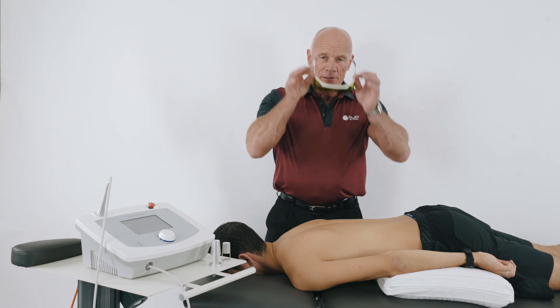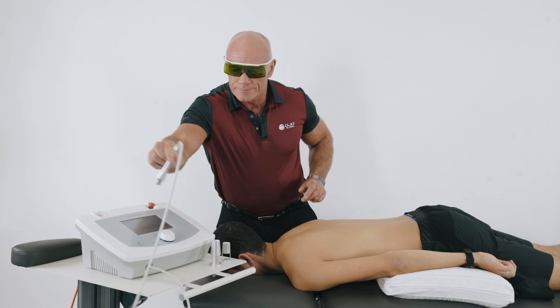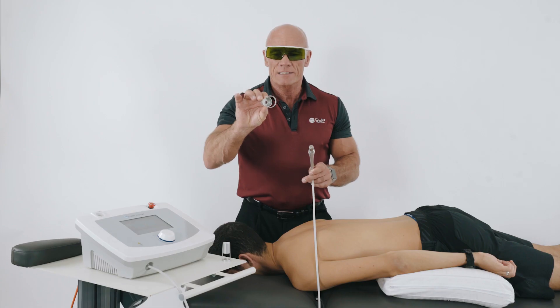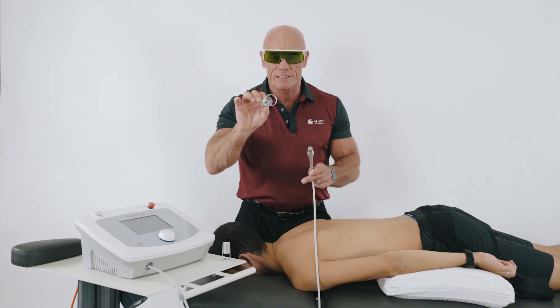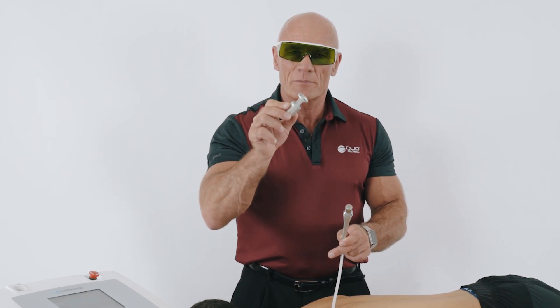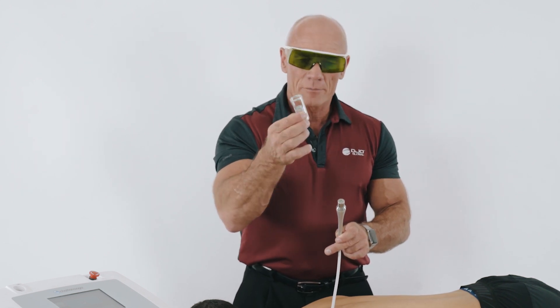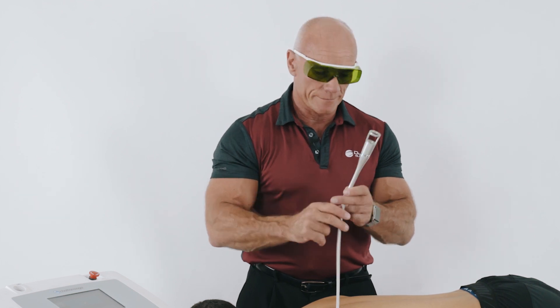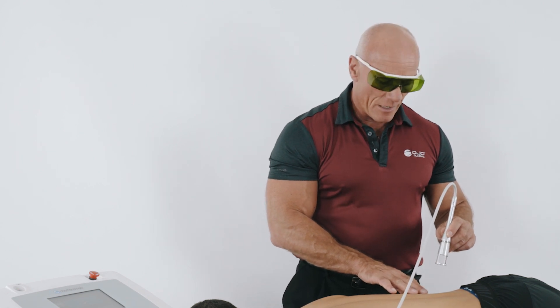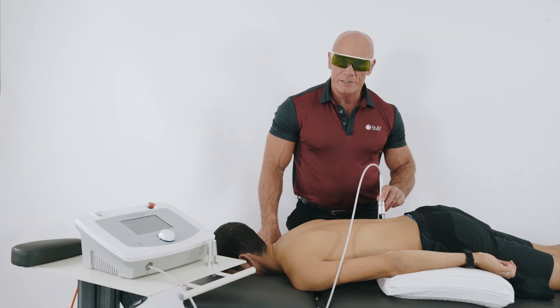It's important that we wear manufacturer-specific glasses. We take our probe and we choose which standoff to use. The larger standoff has a smaller energy density. The smaller standoff has a higher energy density. Because I'm going to treat the trigger point in QL, I'm going to choose to use the smaller one. I earlier palpated the myofascial trigger point in QL, so I've localised it and I'm now going to start my treatment.